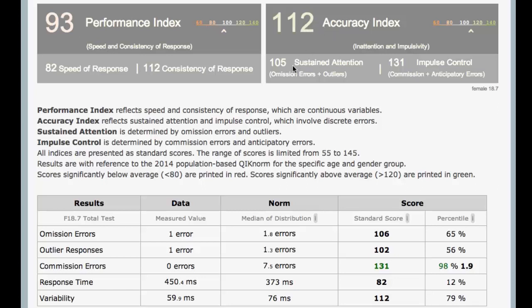Same over here with accuracy index. So 112 combines 105 here for sustained attention. This is omission errors and outliers, and you see those here. One of the really neat things that's happened here is that we've included outliers. One of the great things about this dataset and other CPT research is that outliers correlate with omission errors, so this allows us to combine them.